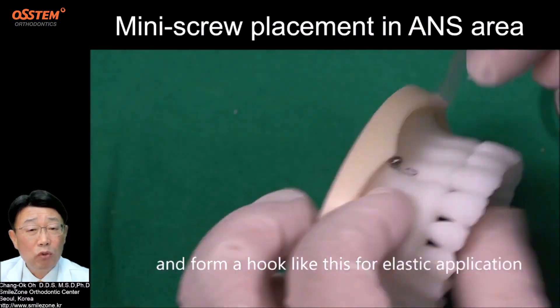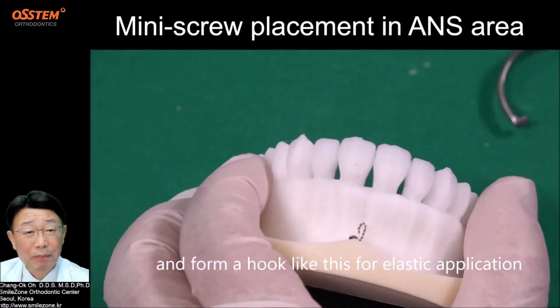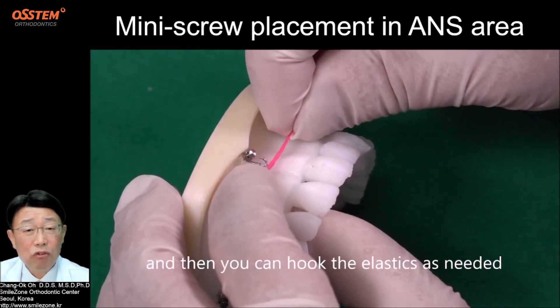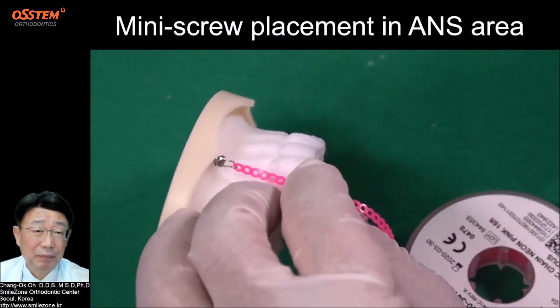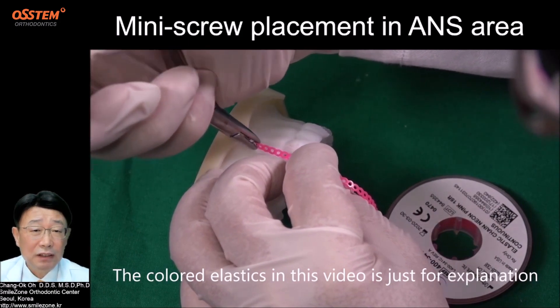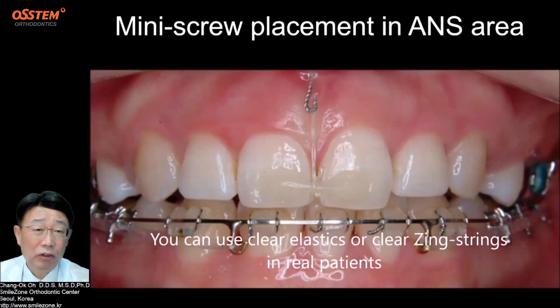Form a hook like this for elastic application, and then you can hook the elastic as needed. The colored elastic in this video is just for explanation — you can use clear elastic or clear Zing-strings on a real patient.